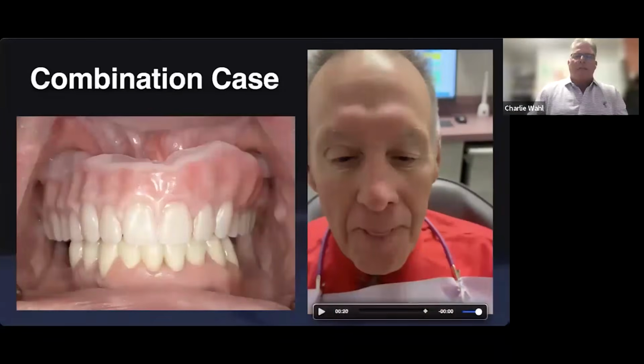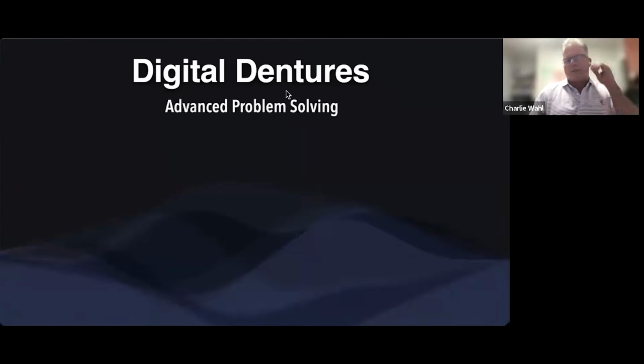And that's my favorite sound of a denture when it finally releases. You hear that, big old suction sound. So I was really happy with that. Patient had to work hard to get it out. We feel like we're pretty close to being ready to get to a final denture.